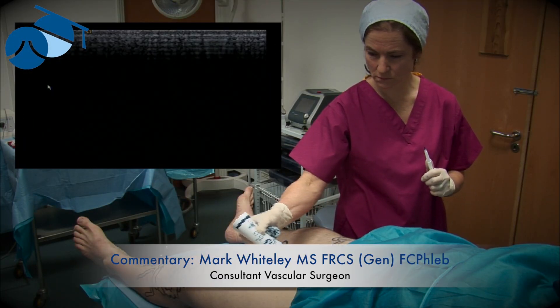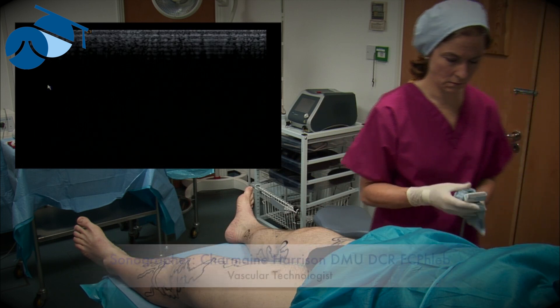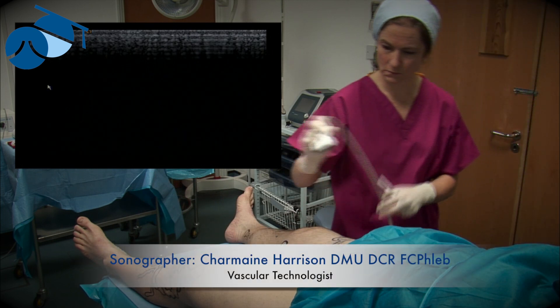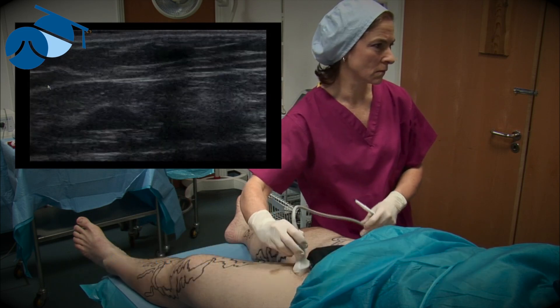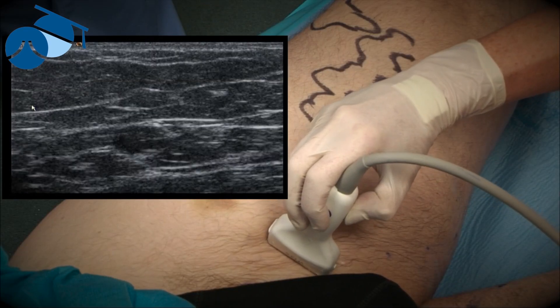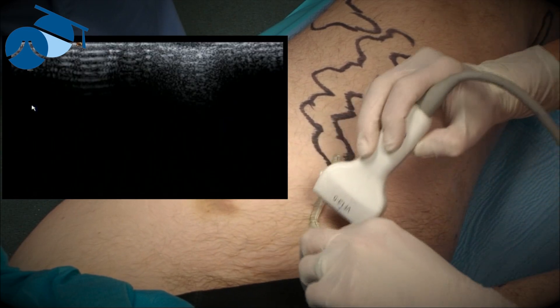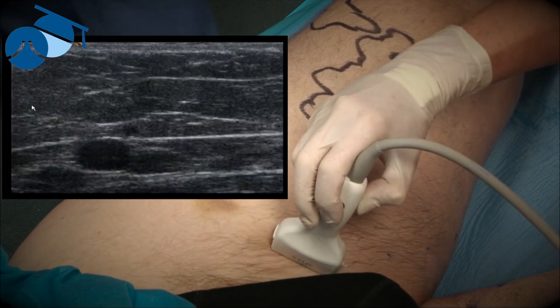This is marking of the left anterior accessory saphenous vein, and we can see already that there are classic varicosities for an anterior accessory saphenous vein or lateral thigh vein incompetence. The vascular technologist is now doing a transverse scan just to check that the anterior accessory saphenous vein is below the fascia and how long it's below the fascia for.